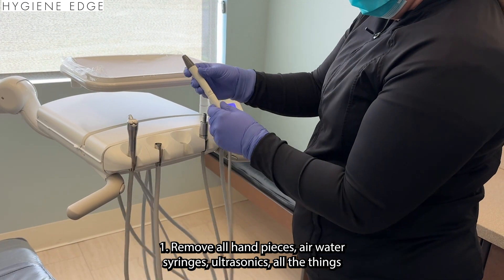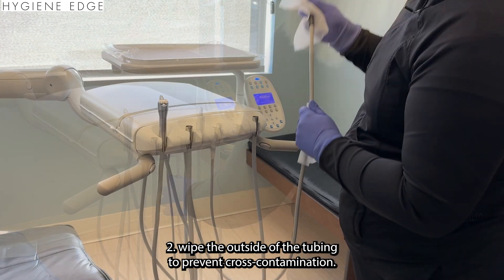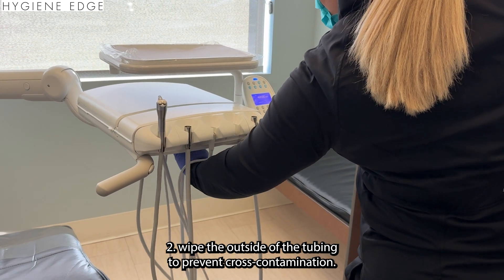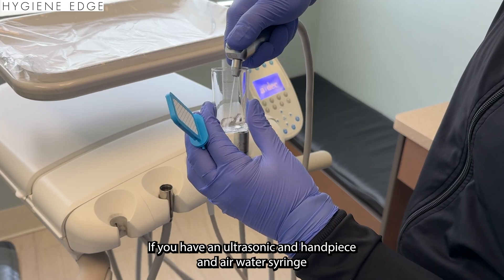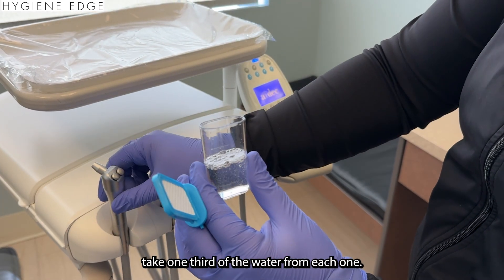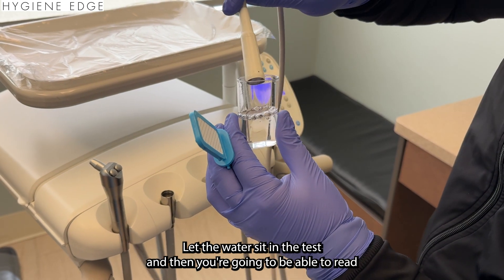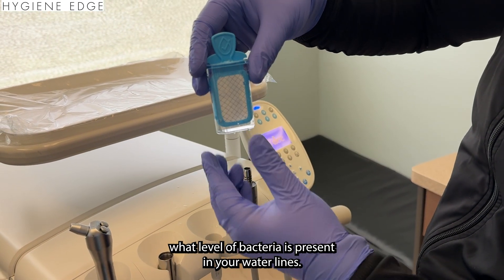Step one: remove all handpieces, air water syringes, ultrasonics — all the things. Step two: wipe the outside of the tubing to prevent cross-contamination. Step three: take equal amounts of water from each of the op's water lines. If you have an ultrasonic, handpiece, and air water syringe, take one third of the water from each one. Let the water sit in the test, and then you'll be able to read what level of bacteria is present in your water lines.